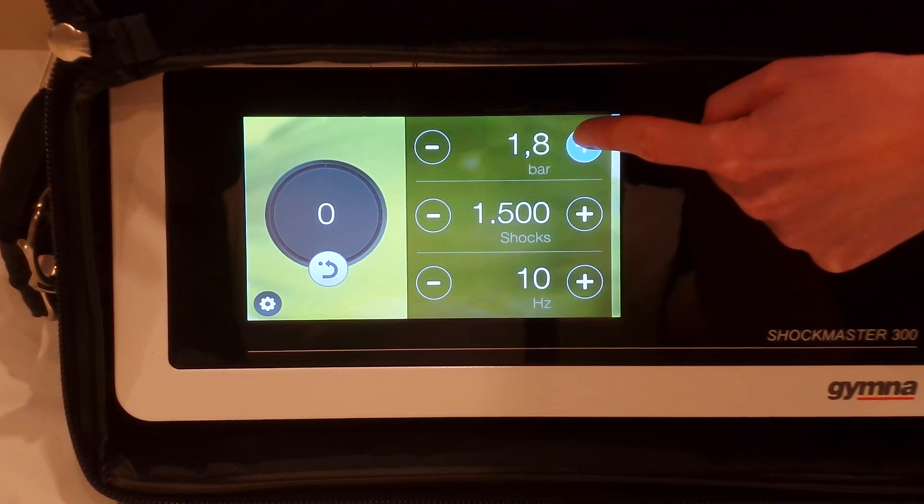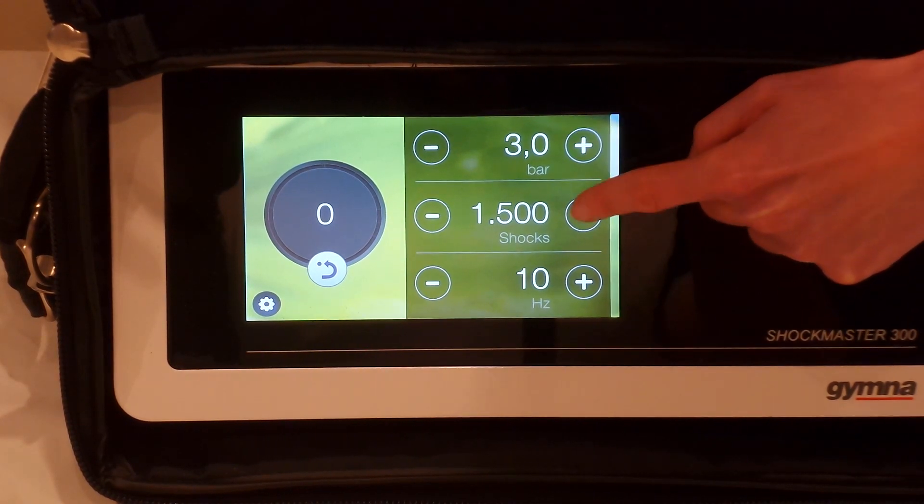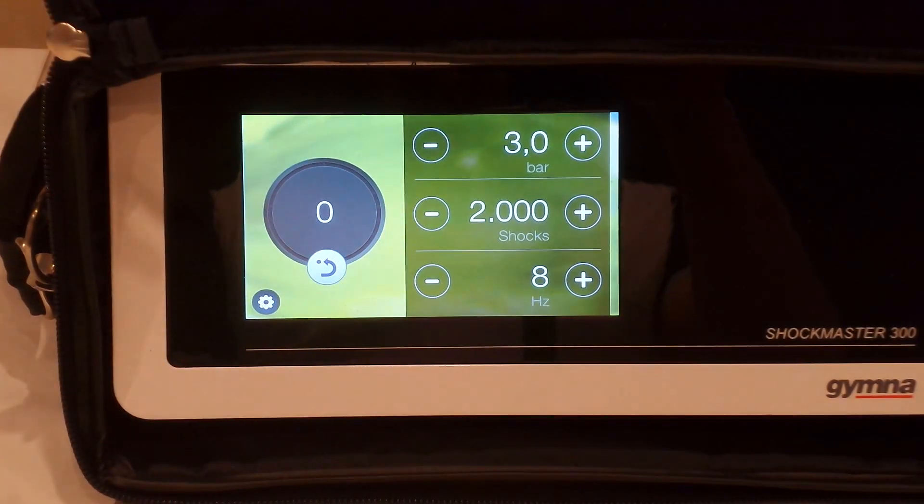This is treatment for proximal plantar fasciitis. We're going to increase the power to 3 bar, come for 2,000 shocks, and go along at 8 Hertz.